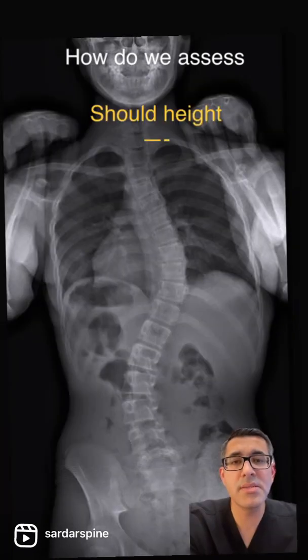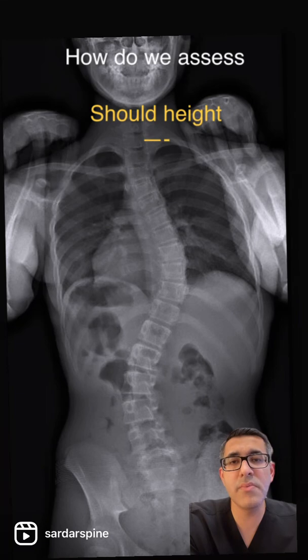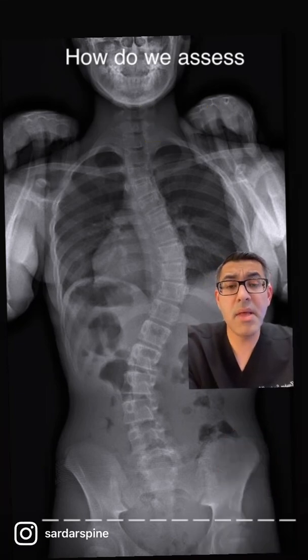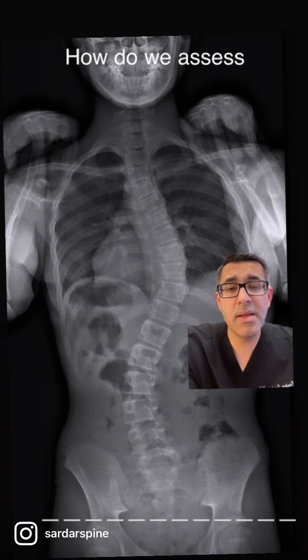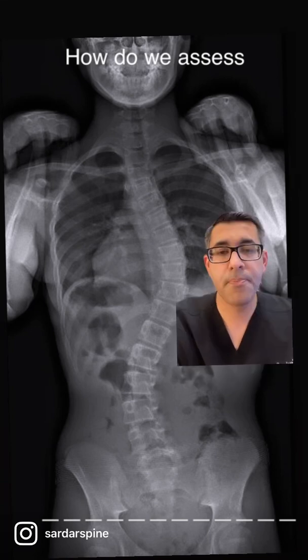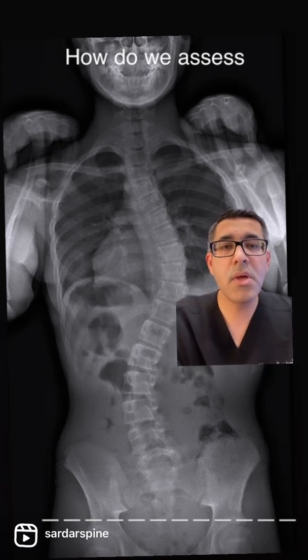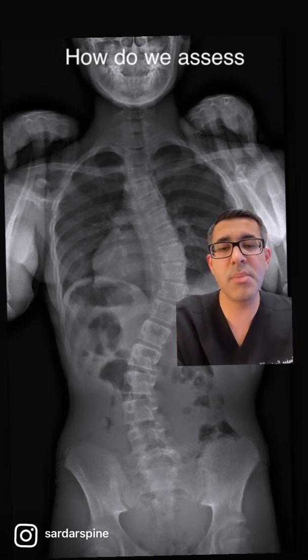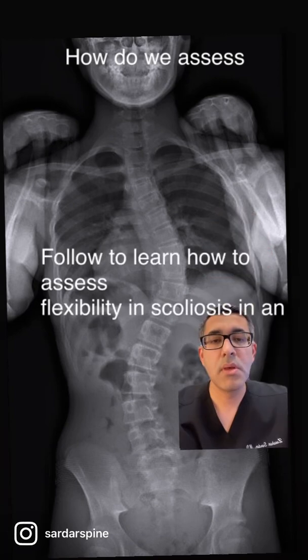Another thing we look at is the shoulder balance to determine which shoulder is higher. And finally, we look at the pelvis and the length of the legs. We can look at the hips or the triradiate cartilage to see if the patient still has growth remaining.